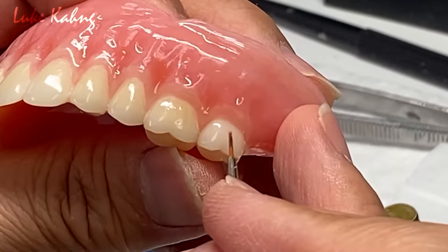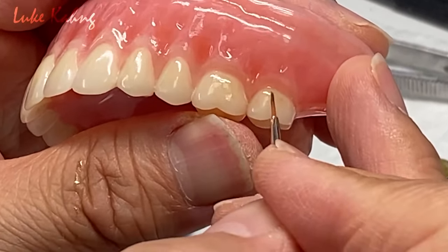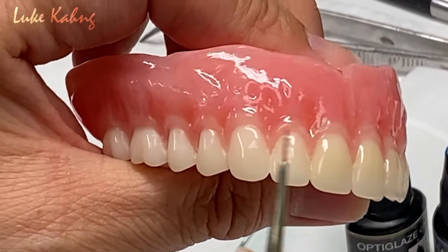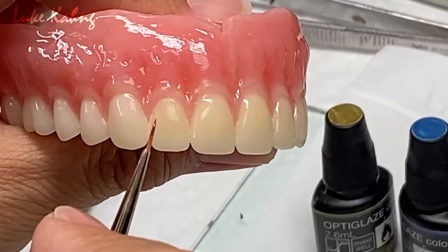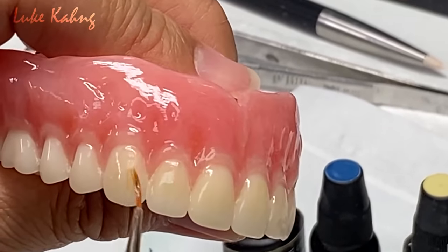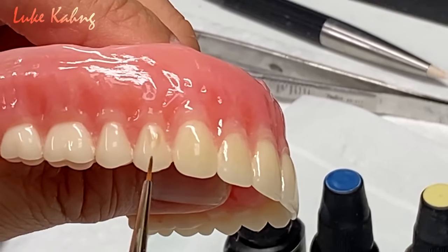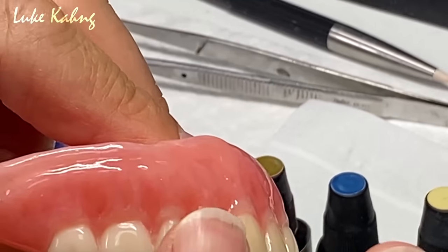So I like the denture translucency already. See, light, dark, okay. Yes. So we don't have to put too much, very light. That's it. See all this, see, light and dark. It's like kind of about two tones up. Too much then. Using the hand, finger, yeah, nice. See light? Okay.